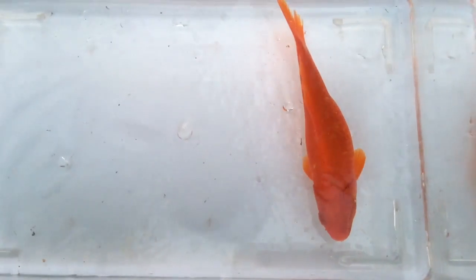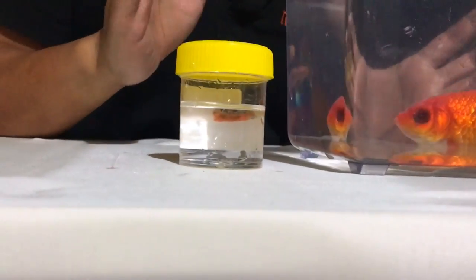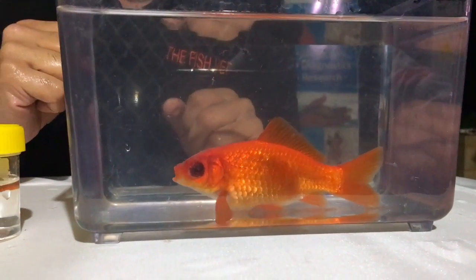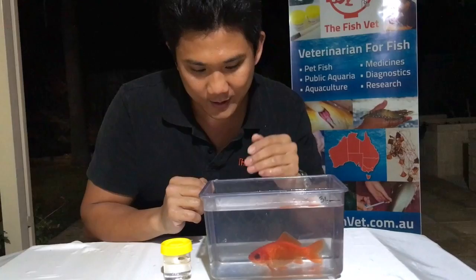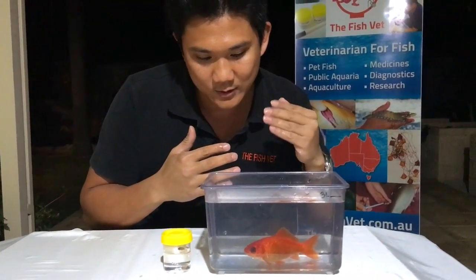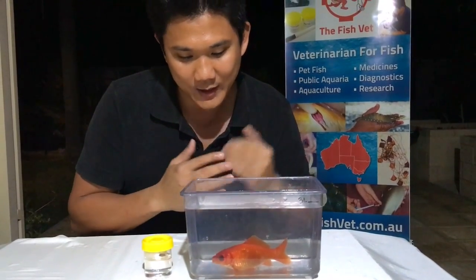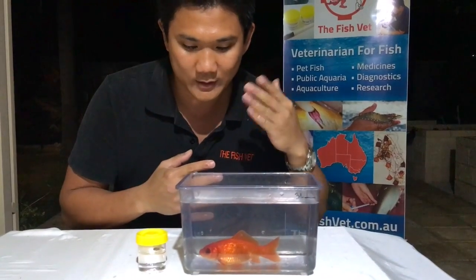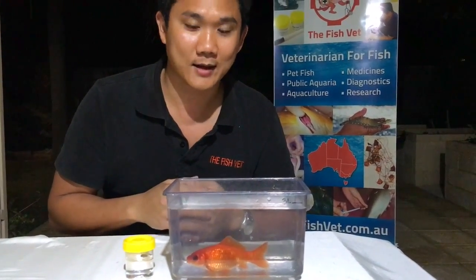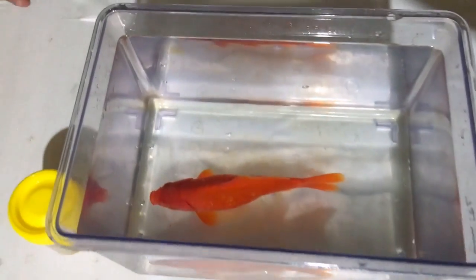So there you have it — exenteration of the eye of a goldfish. In terms of post-operative care, we can give another injection of antibiotics about three to five days later, depending on water temperature — the warmer it is, the shorter the interval. Also give one more injection of anti-inflammatories. Over the next month or so, that eye defect is going to re-epithelialize with skin growing over it — it will be pale pinkish in color, slowly getting shallower and shallower, eventually becoming a slight depression. You might even get some orange pigment growing over that, so it won't look as gross as it does now. And if you look at him from the top, you wouldn't notice much difference, especially in a pond full of other goldfish.